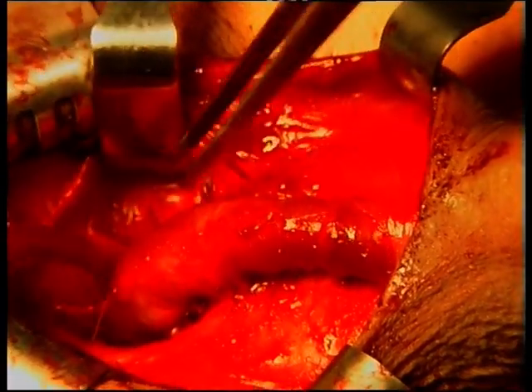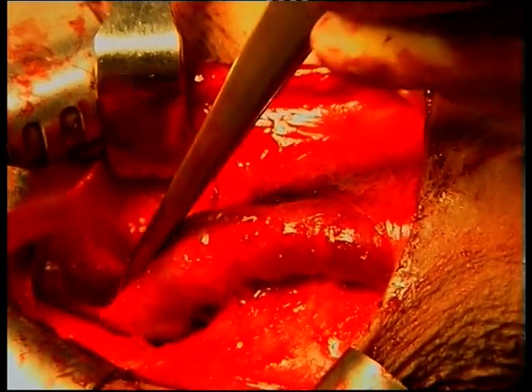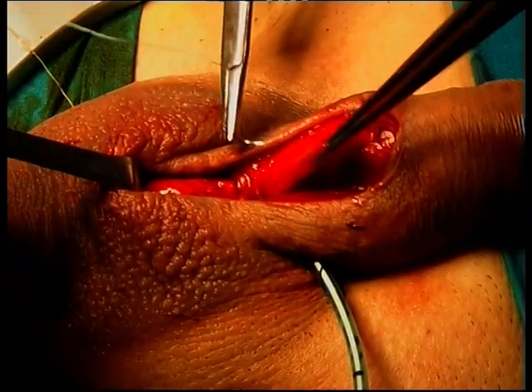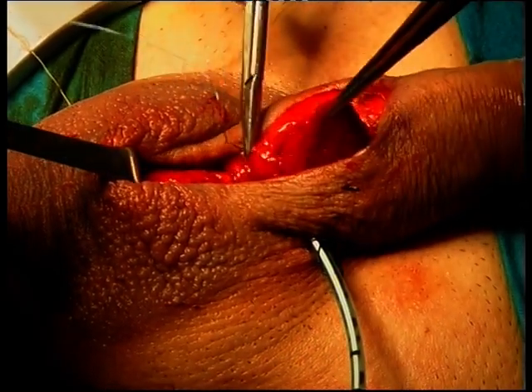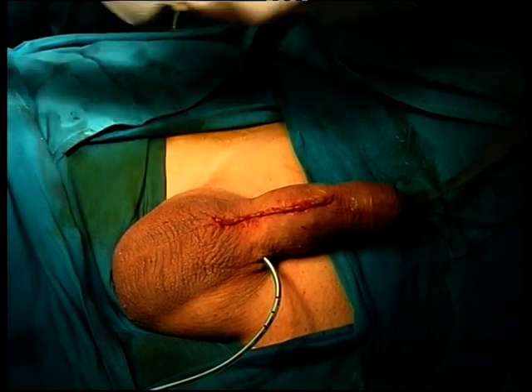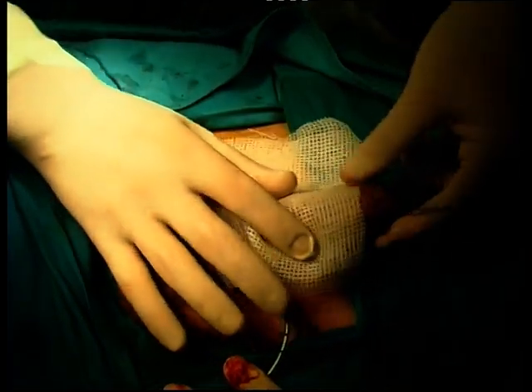After finishing the repair, we can observe that the urethra remains sutured to the corporal bodies. We leave a small suction drain for 24 hours and close the subcutaneous tissue over the urethra before proceeding with the skin suture. A slightly compressive dressing is applied to prevent edema and hematoma.